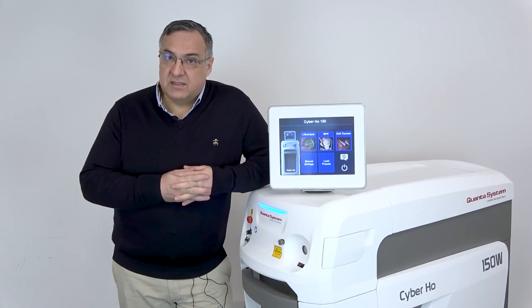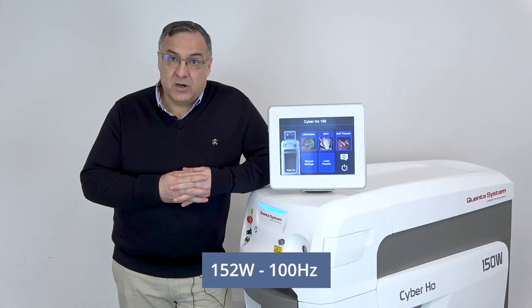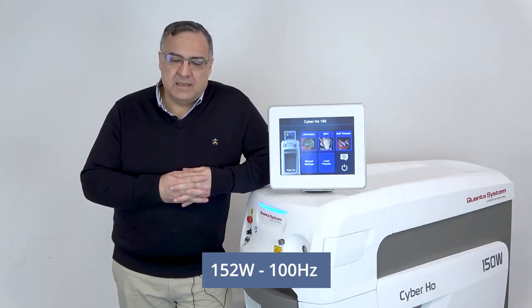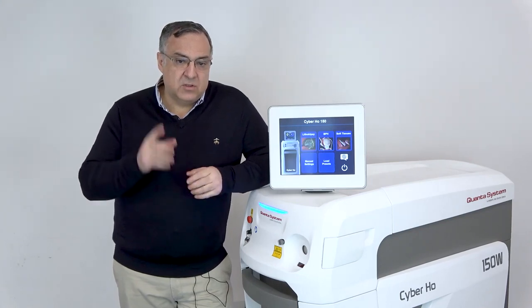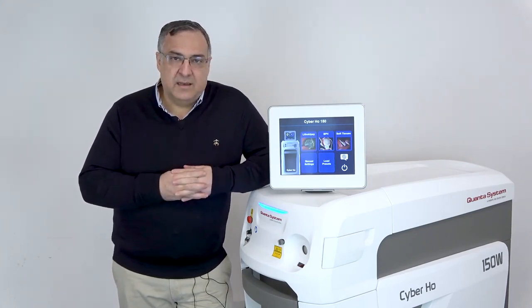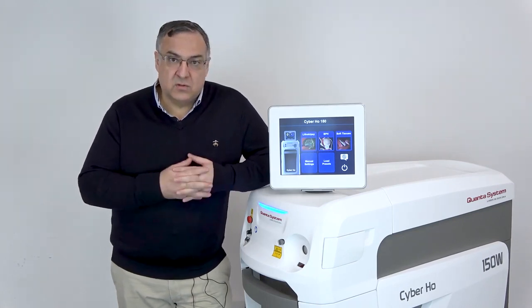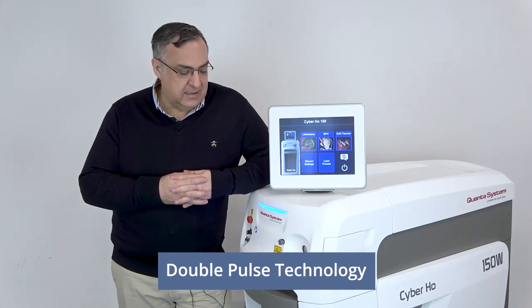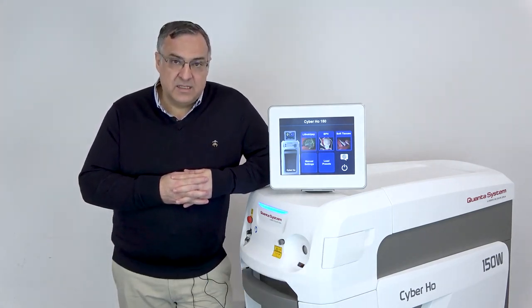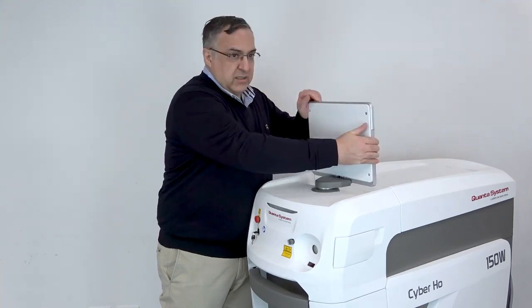This laser has very impressive specifications, allowing delivery of 150 watts, 100 hertz, and it has a sophisticated pulse modulation. It can deliver two pulses very fast, one after the other — what we know as virtual basket, double pulse, or double bubble — which increases the ability of the laser to cut and coagulate. So let's unfold this and I'm going to unleash the beast.